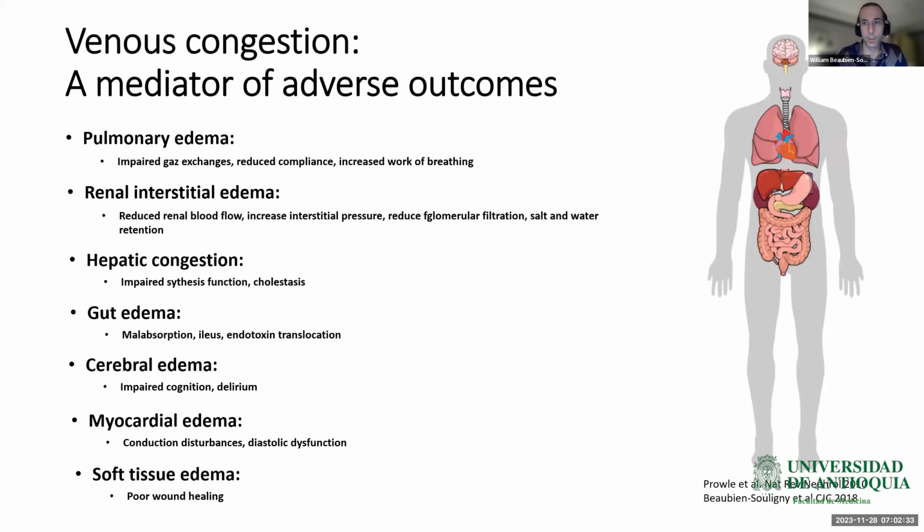So this is one of the most influential editorials, written in 2016, that made the association between those signs in the kidney, the hepatic vein, and the portal vein, these venous Doppler alterations, suggestive of venous congestion.